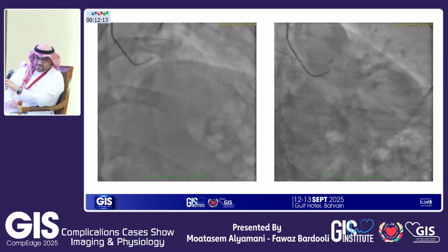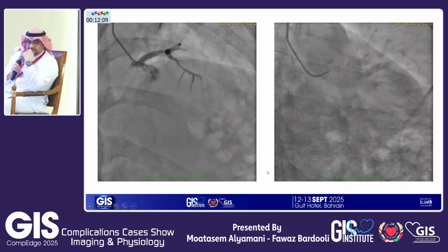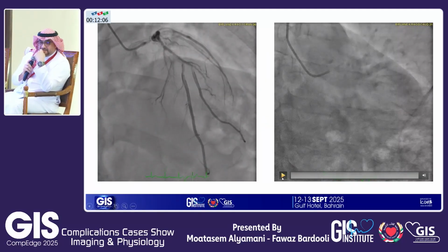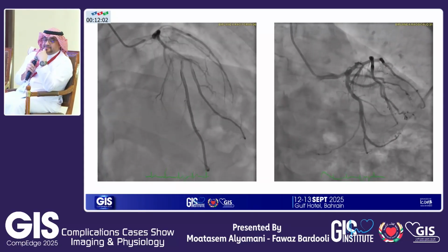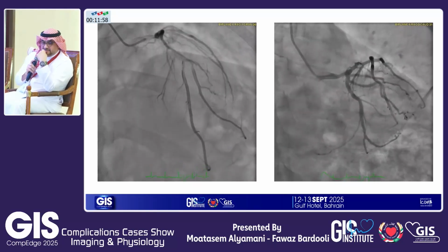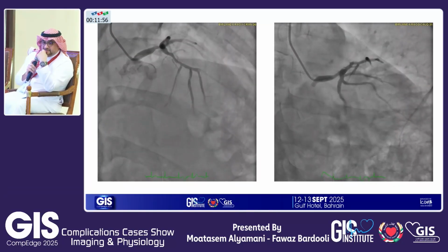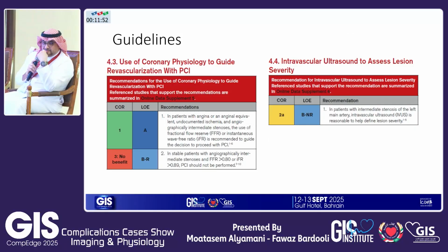So I think I'll go for physiology here in this case because I think if you put FFR, most likely it will be positive because of the cumulative lesion, the left main and the LAD. Whereas if you put it in the circ, it will be negative most likely. And this is because of the downstream lesion in the LAD, and because physiology depends on the flow, and the flow will be reduced in the circ because of the downstream lesion.